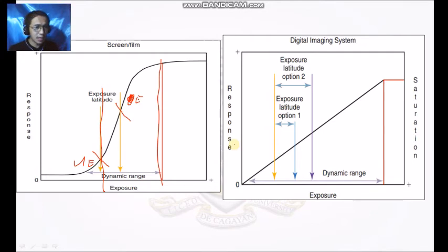But then of course, as rad techs, we also have to practice the correct collimation and the correct technique factors. So please do not use exposures that are too much or exposures that are too little, because that would also result in a very noisy image or an unacceptable image.